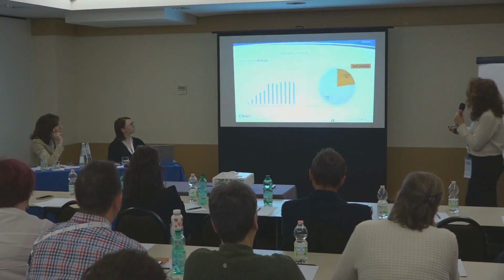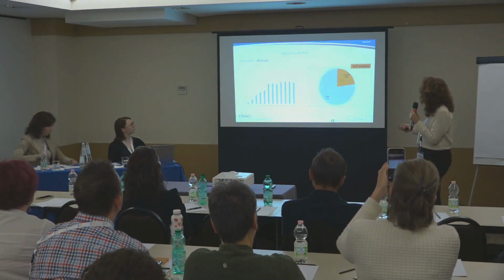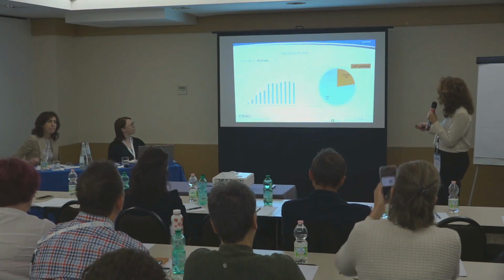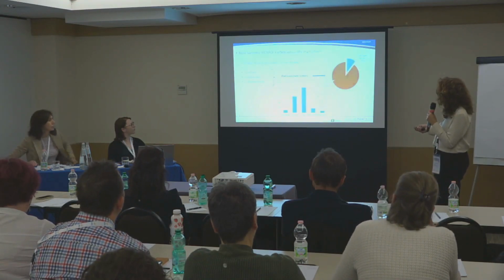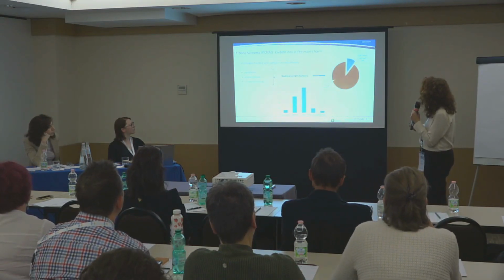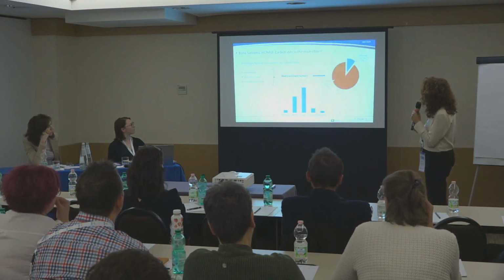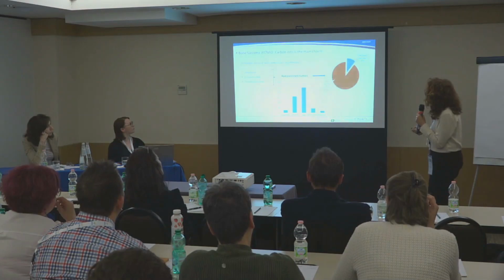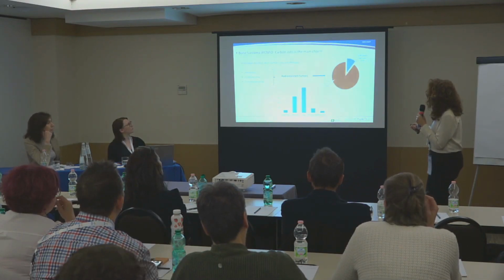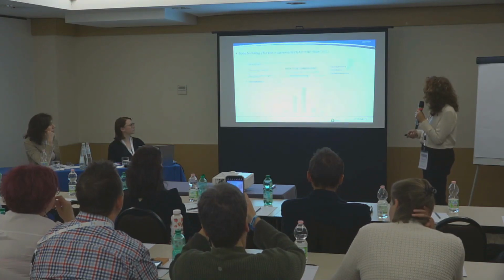We started in 2011. We have treated almost 5,000 patients. Among the sarcoma patients we treated, 89% were bone sarcoma, and in our center, carbon ions are the main choice for sarcoma.